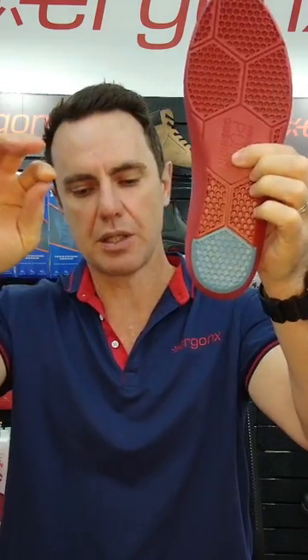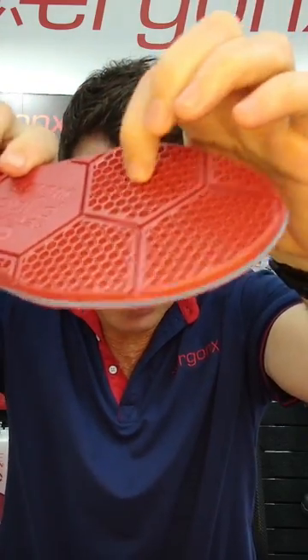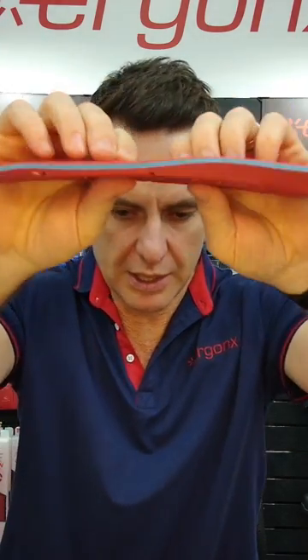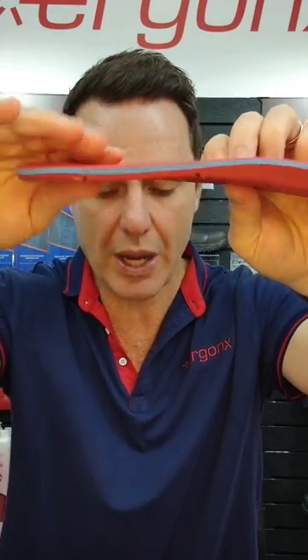It's got this rear foot cushioning position and these forefoot honeycomb sections that really hollow out and make a great shock absorbing area. It's also got a layer of memory foam between the polyurethane and the brushed suede upper.